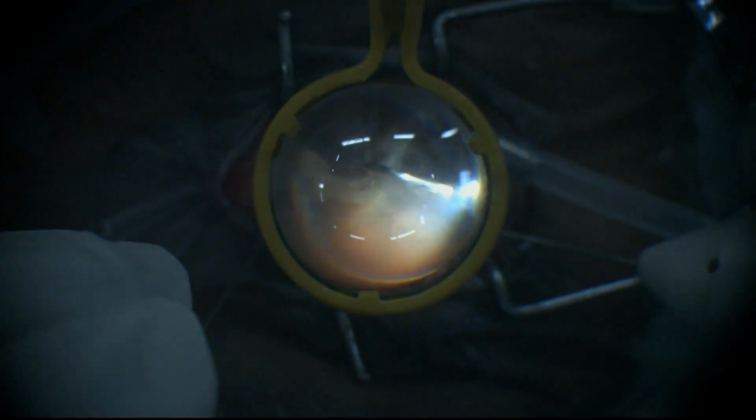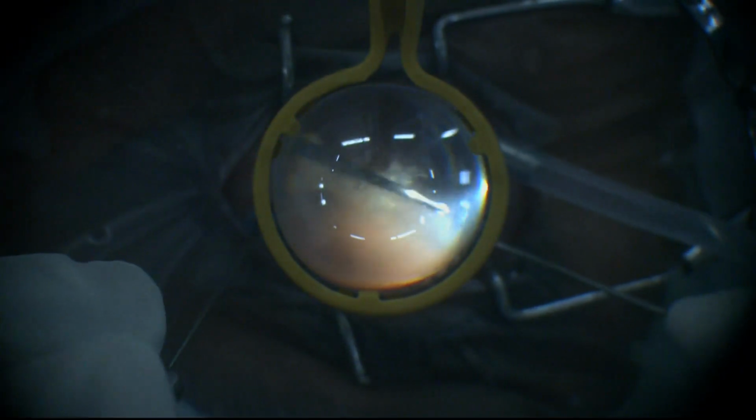The wide angle viewing system has an optical phenomenon that at the plane of the cornea, all the rays that are emerging and going in have a small footprint because it's a convergent beam. So at that point, even if you have a very small aperture, it works.